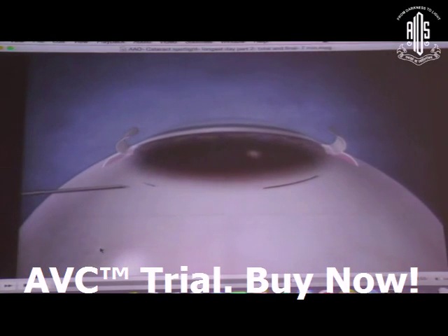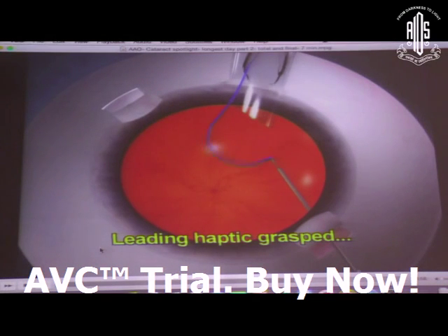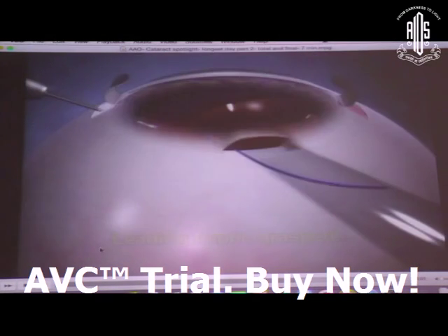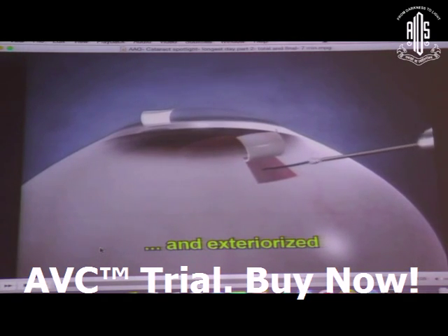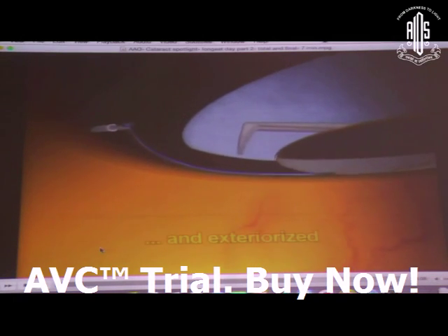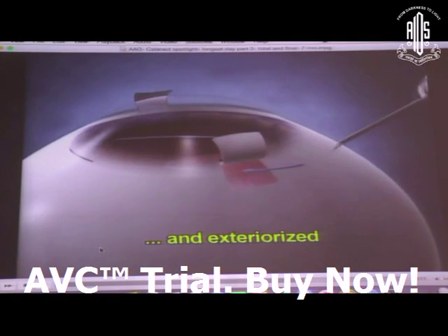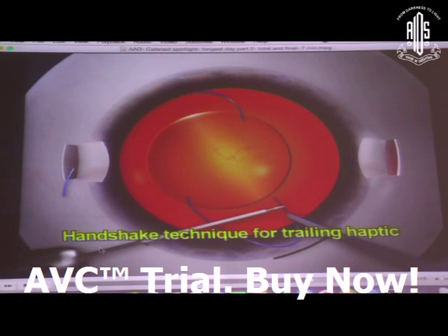So very simple way for all of us to understand is, obviously I'm going to inject this lens, catch the haptic, pull it out, and then do the handshake technique so that my trailing haptic also comes out. So it looks very easy now. So when I went on the table to do it, as I told you, this is the handshake technique which I'm showing on an animation, how that's done.